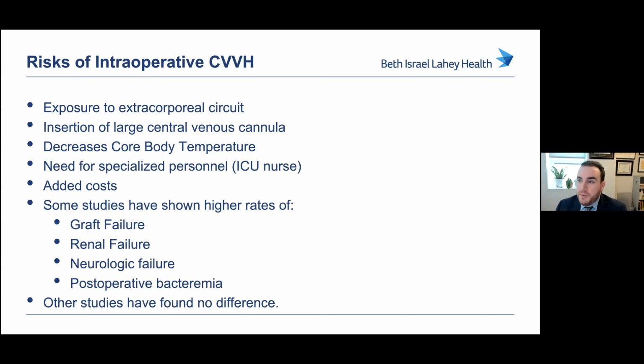Citrate will also prevent filters from clotting, but it requires calcium to be given intravenously, as the citrate will bind the calcium in your bloodstream, thereby causing hypocalcemia. The third way is to not anticoagulate these patients, and when they come to us at Leahy, we don't provide them with citrate or heparin to keep them from clotting.